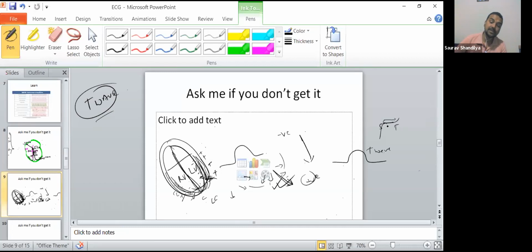Why is it keeping silent for some time? Because it is not getting potential, so it has an isoelectric line. Simple, just like PR. So that is the reason ST is so important. If you talk about the ST segment, more than this, we'll talk a little later. Okay, fine. Now the T wave, as I told you, all negative flipping to positive.